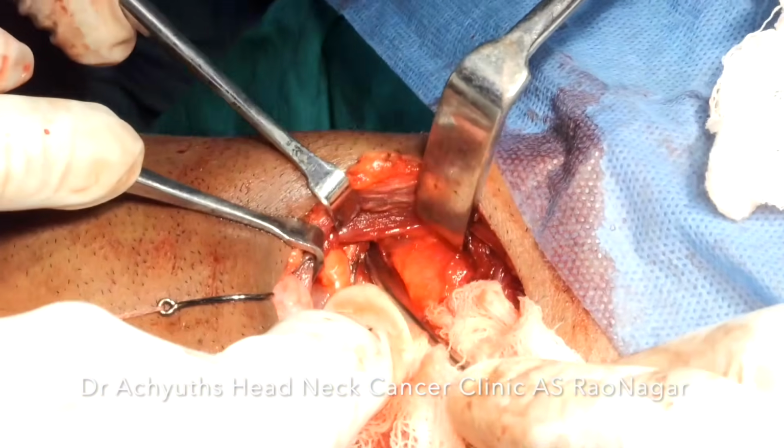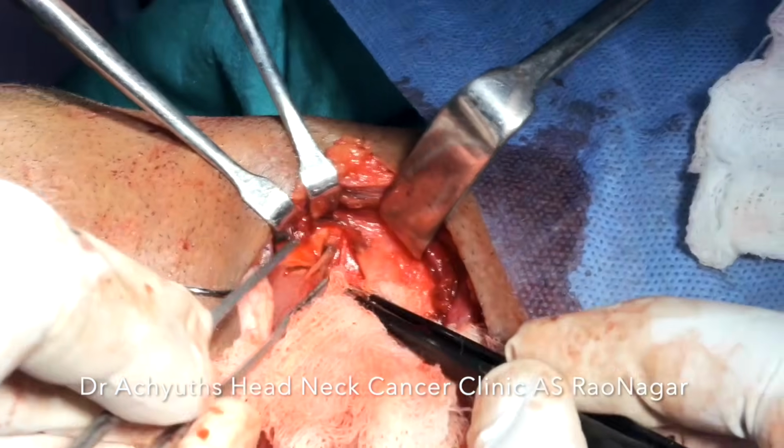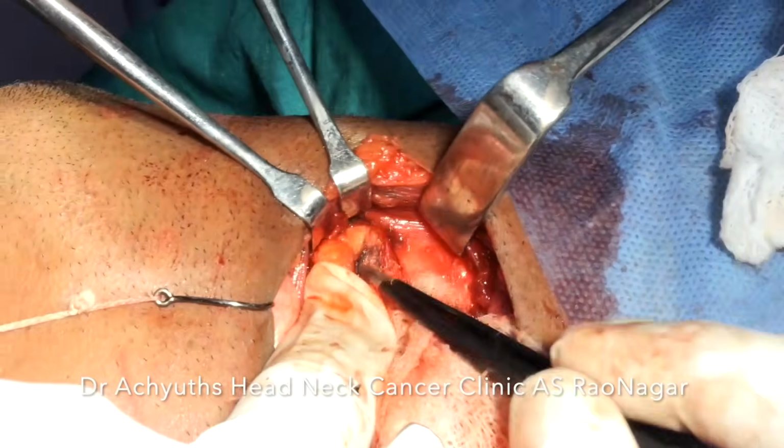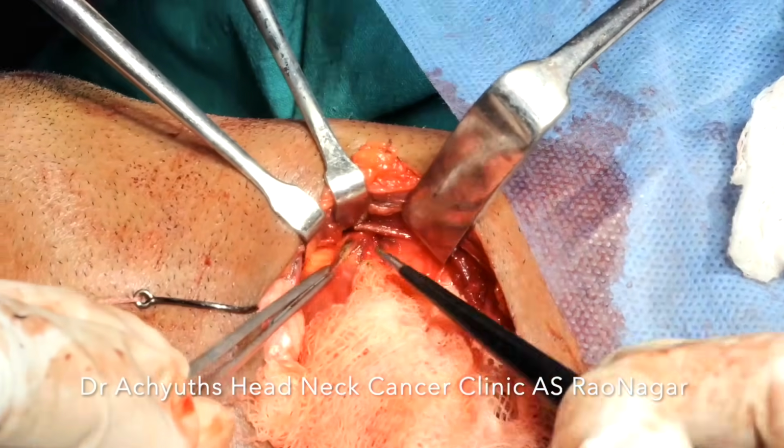So again, with the help of blunt dissection, we are trying to see where the fascia would be. And so this is the attachment now.